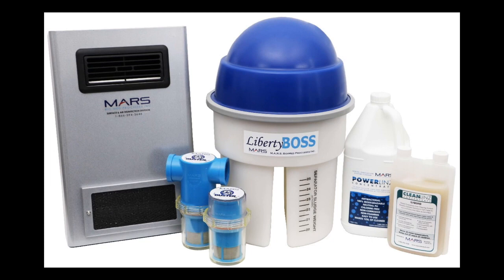Thank you for choosing to upgrade your amalgam separator and join the Mars family of environmentally friendly dental practices. This short video will show you how to upgrade from your old amalgam separator to the best available technology in amalgam separation, the Mars Liberty Boss.